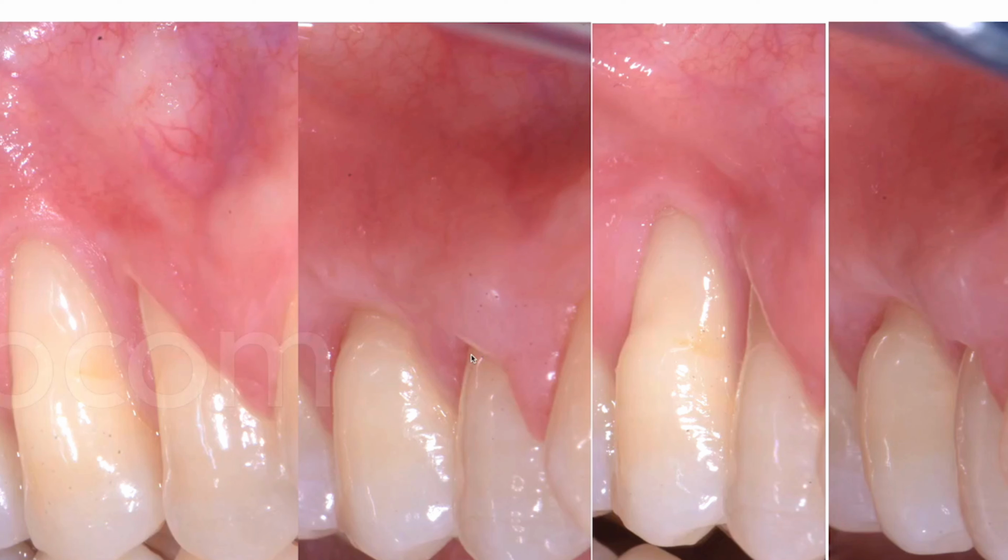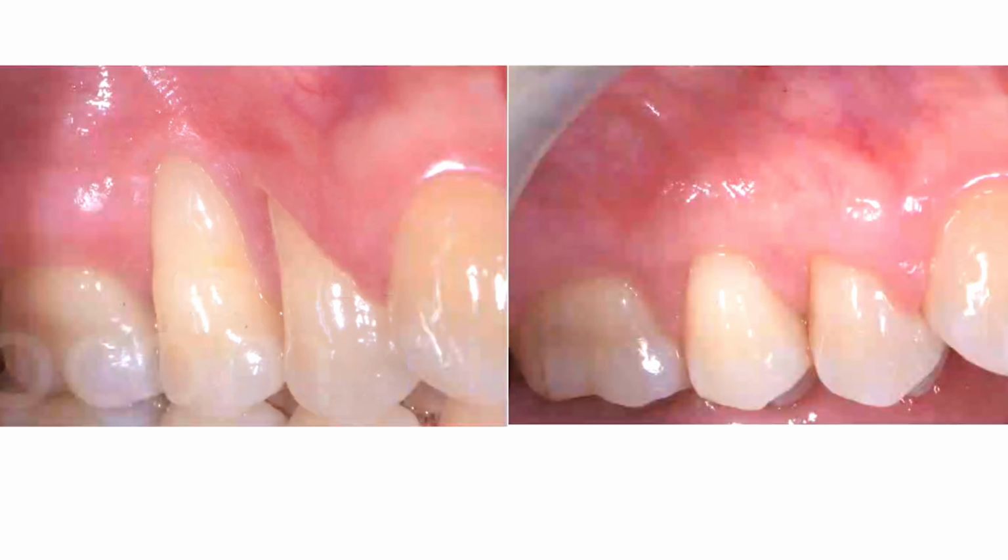Now you achieve more vascularized proportions. So can you do it again later? No. Because now you have this, a wider papilla.